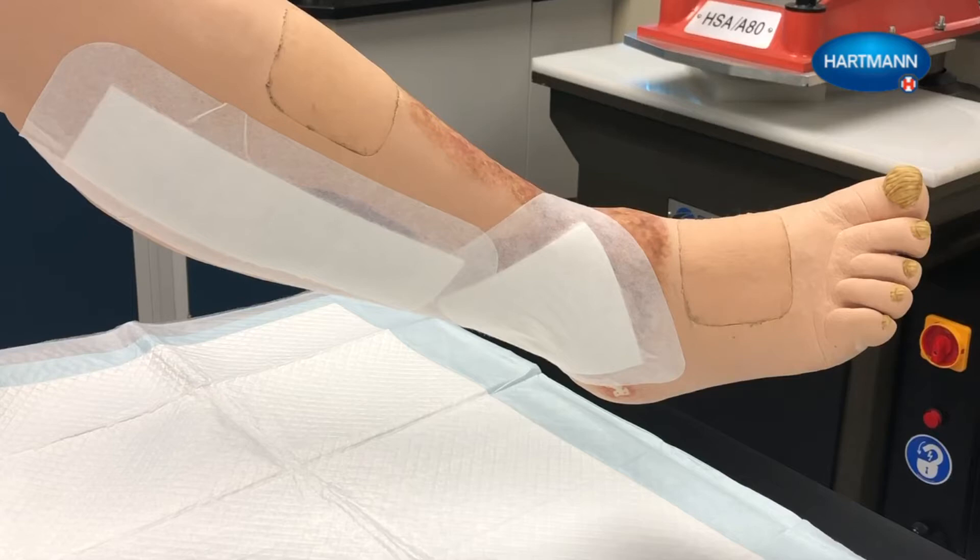Clean the wound and apply an appropriate dressing before ForePress. ForePress is not intended to be a primary bandage. When applying each layer, make sure that the patient's foot is at a 90 degree angle to the lower leg.